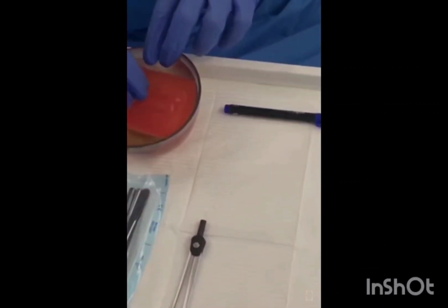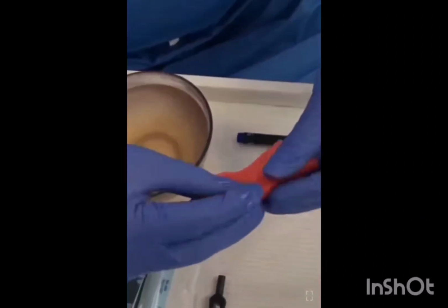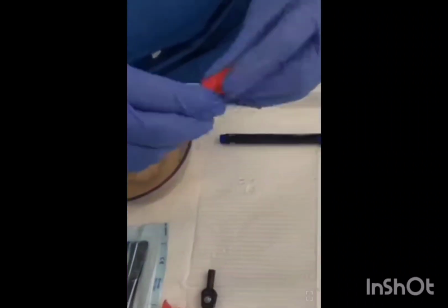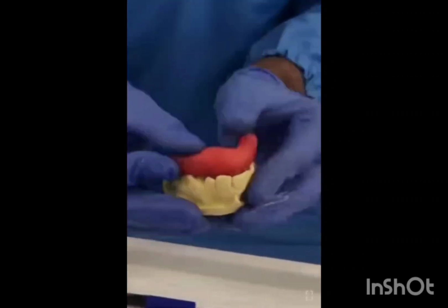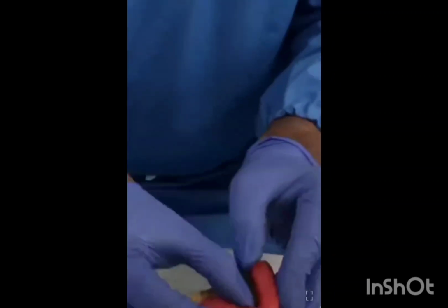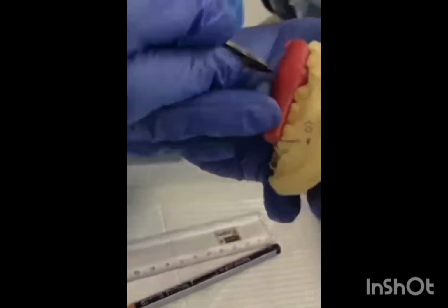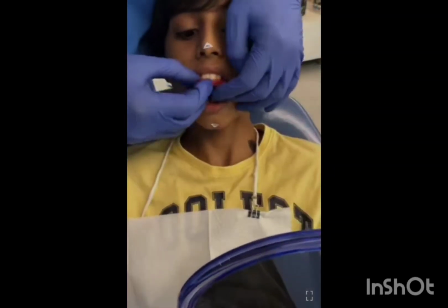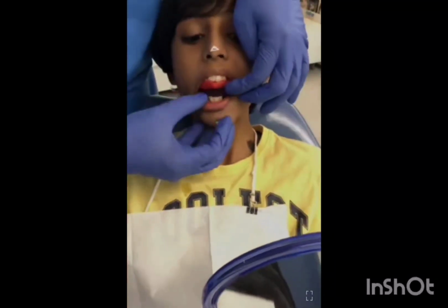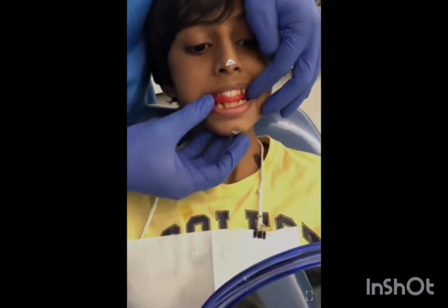So here we take a wax sheet, put it in a hot water bowl, and roll it to form a wax block. It is adapted in the arch form and placed on the cast to form indentations on it. We also mark the midline and two reference lines. Now this wax is placed in the patient's mouth, the mandible is guided forward, and the bite registration is recorded.